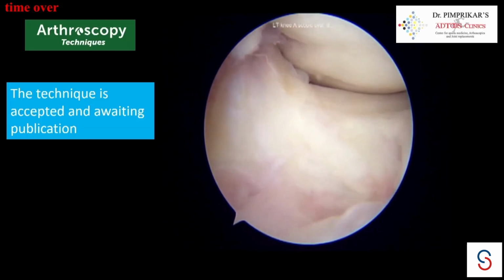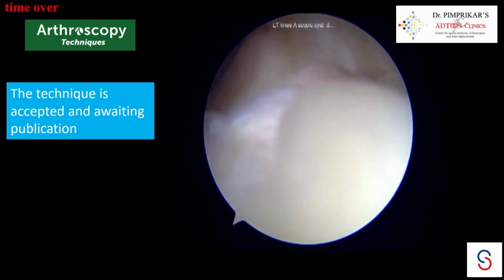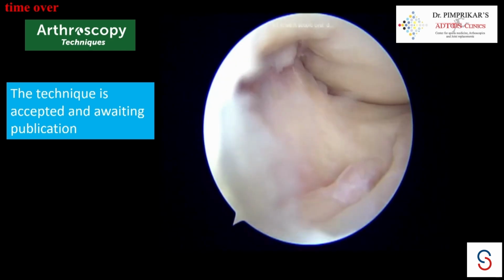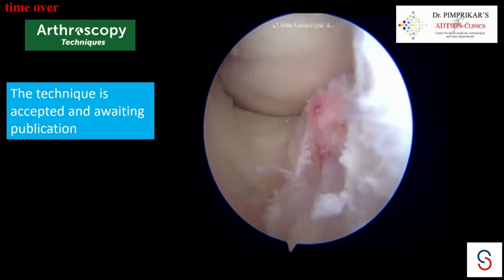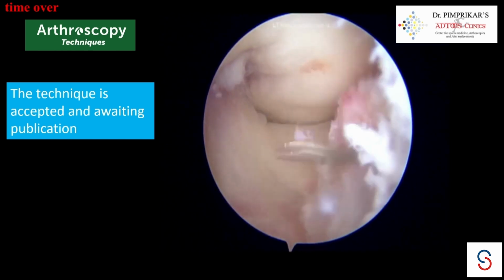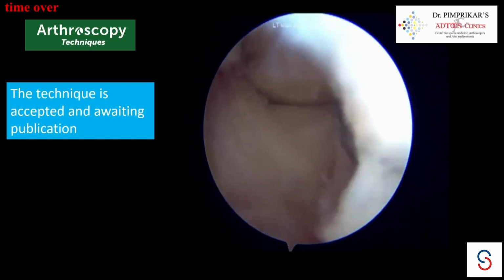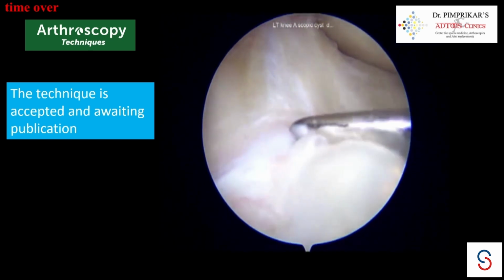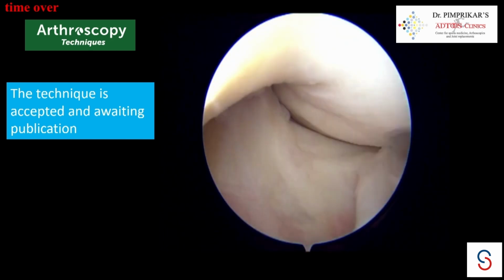So, we have presented this technique of repairing the anterior horn. That's the anterior horn of the lateral meniscus there, and that is the cyst. You come from within the cyst into the joint with a spinal needle, put your shaver in, and take off whatever you have there. That's the needle coming in, shaver coming in now, and then you shave off the whole cyst wall. We also took a biopsy to confirm that this is a perimeniscal cyst, and that we normally do.